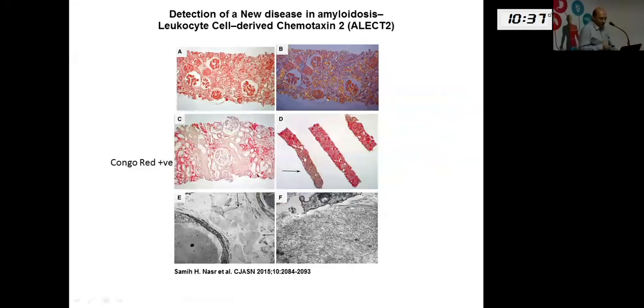Again, shifting our octagons, detection of new diseases using the newer technology. As you know, this is a picture of amyloidosis: Congo red positive stuff, birefringence, and fibrils on electron microscopy scattered at random of a particular size. This is amyloid. Now, we know that you can get sugar in fibrillary form that we can buy in the bakeries. Here's protein in fibrillary form. There is amyloid. There are different other types of fibrillary deposits.